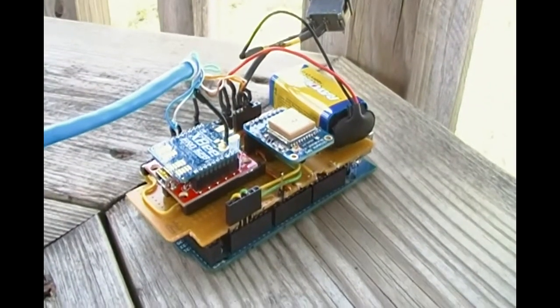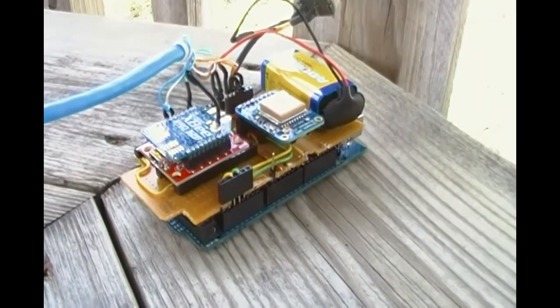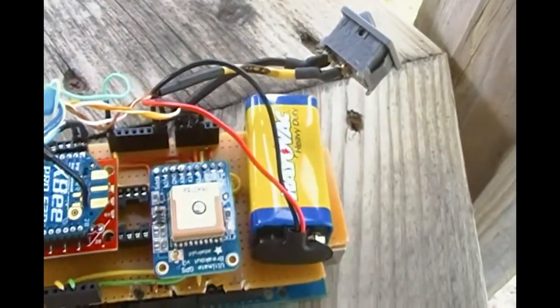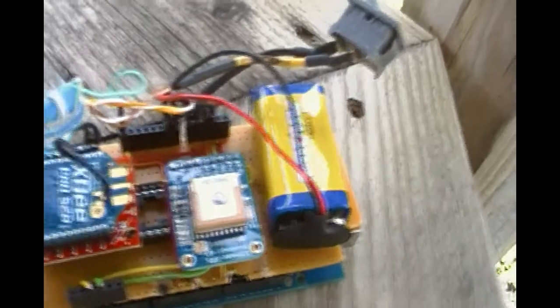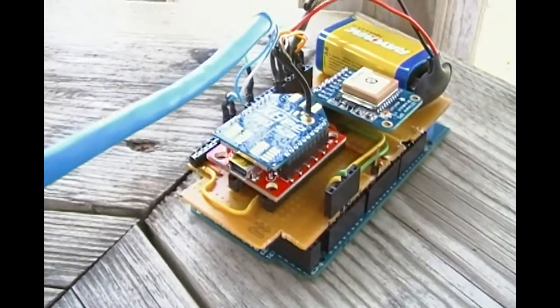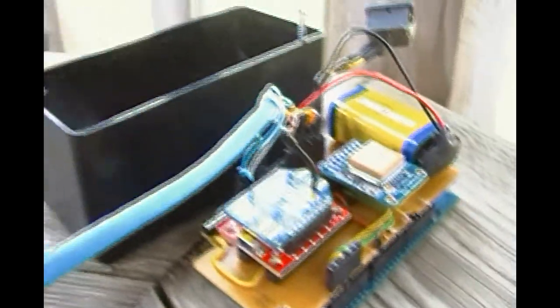Here we have the prototype of the MEDRACE medical monitoring system. On the bottom, we have an Arduino 2560 being powered by a 9V battery. And on the top, you can see the switch that will power on the system, the XBee Pro module, and the GPS module, along with the case.